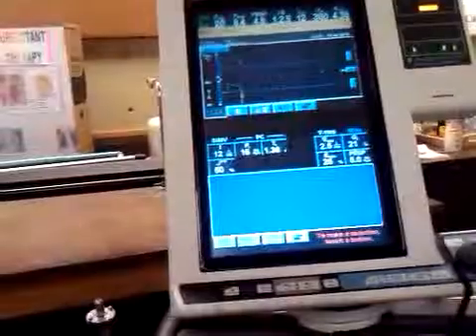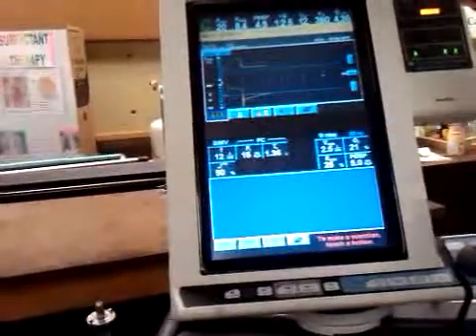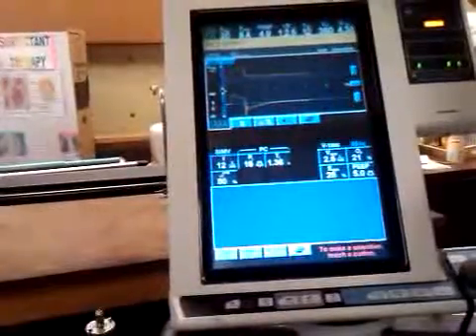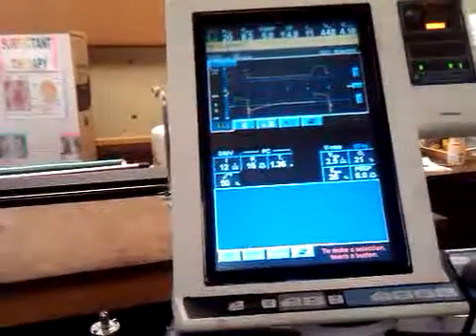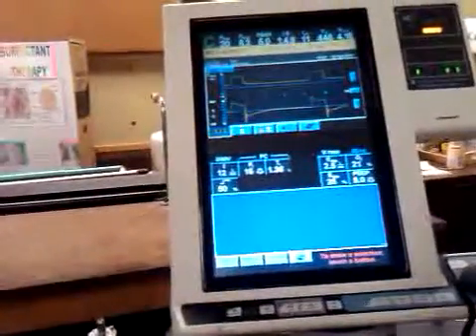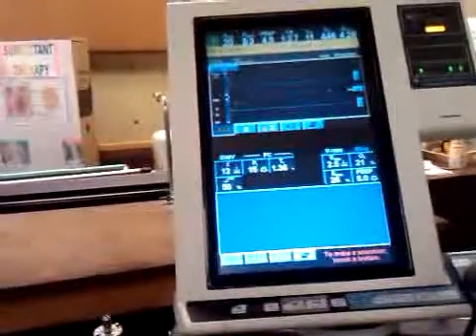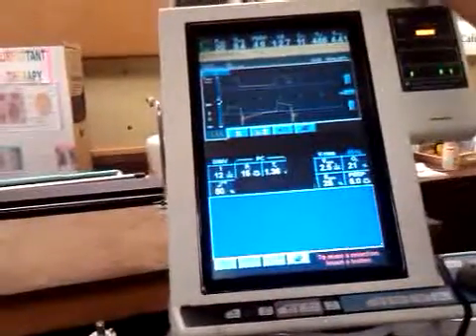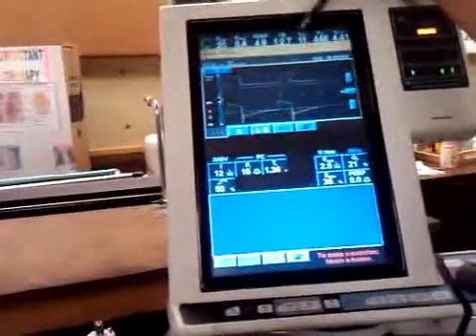To get your SIMV, why is it doing it like that? Wow, that's so long. Andrew, how do I fix that problem? Hello? I know we have a long exhalation phase, but that's not what I'm worried about. I just want to show everybody how to get the P1 and the P2.